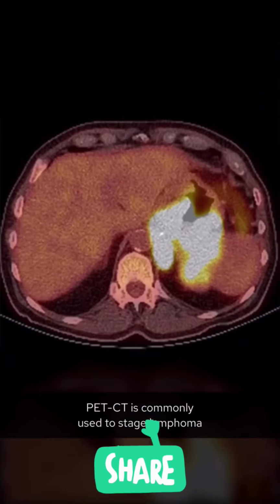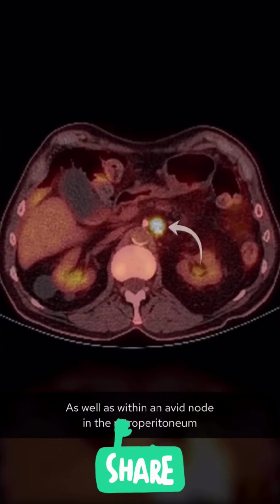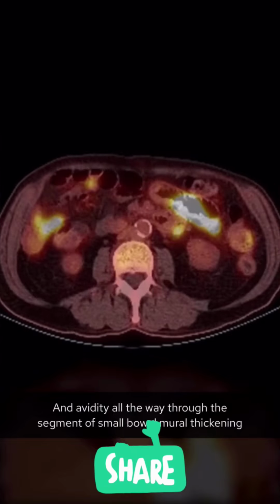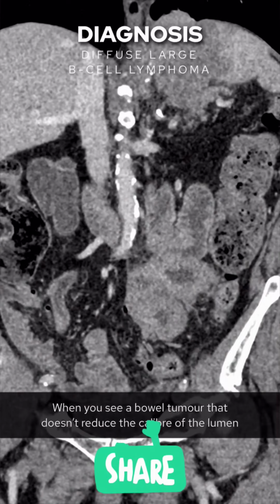PET-CT is commonly used to stage lymphoma and shows intense FDG avidity within the large gastric mass, as well as within an avid node in the retroperitoneum within the left para-aortic region, and avidity all the way through the segment of small bowel thickening. An OGD confirmed a diagnosis of lymphoma. Remember to include lymphoma in your differential when you see a bowel tumour that doesn't reduce the calibre of the lumen.